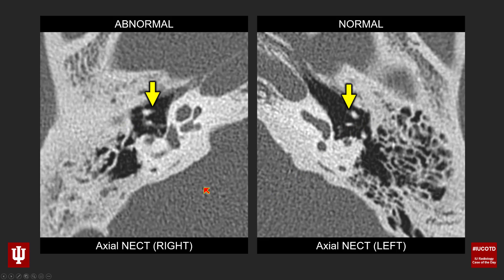Looking at the malleus — the long process and neck — at the attachment site of the tensor tympani tendon, you can see just how thickened the bone is, and look how thick the tendon itself is compared to the contralateral side. You can always see this tendon, but it's nice and thin on the normal left side. To summarize the findings: an under-pneumatized and sclerotic right mastoid, increased density and thickening along the ossicular chain with a studded, calcific appearance, and thickening and increased density of the tensor tympani tendon.